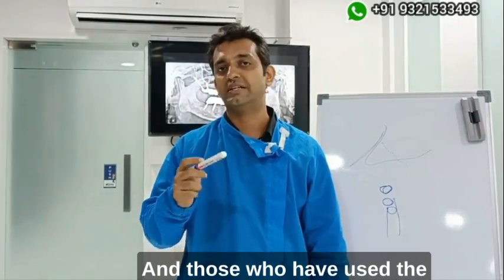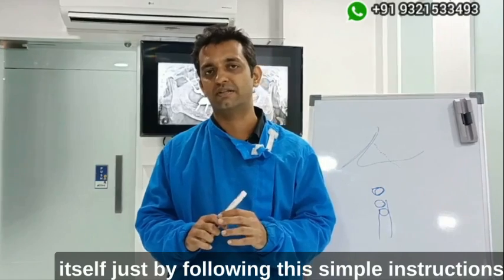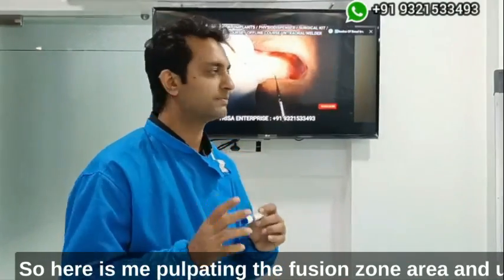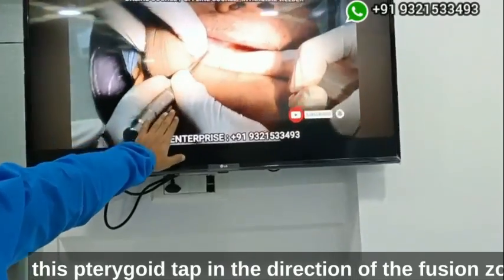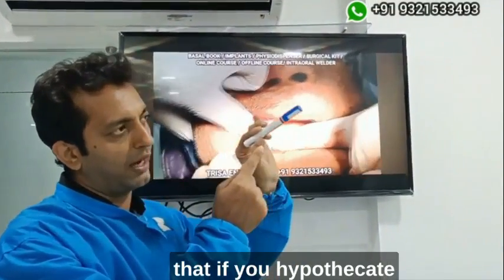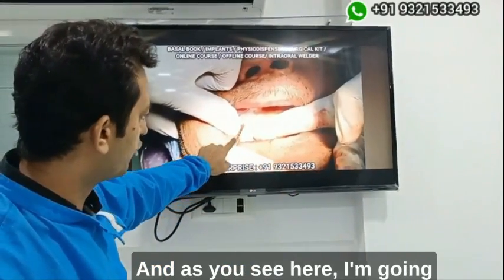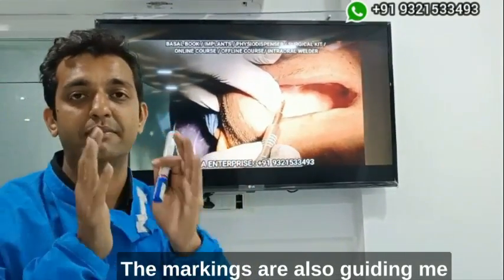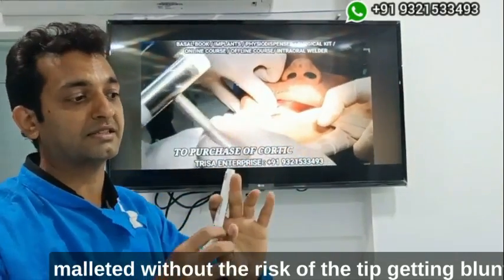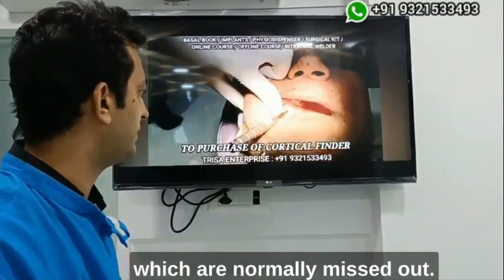Those who have used the pterygoid tap can vouch for what a difference the C-finder makes from day one. Here in the video I am palpating the fusion zone area and using the pterygoid tap in the direction of the fusion zone. It's a blind procedure — if you hypothecate a direction and it's not right, you can always retract and go in the opposing direction. The markings are guiding me as to the depth I'm going. This instrument can be malleted without risk of the tip getting blunt, and the flat end lets you hear the noise while tapping.